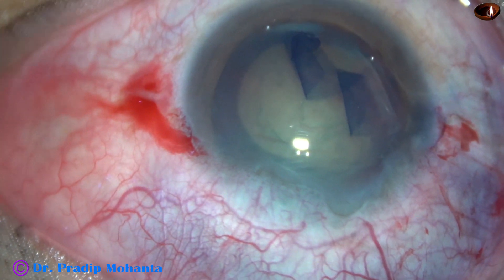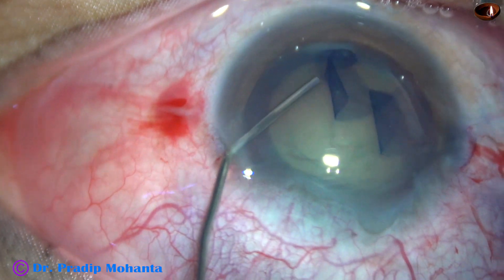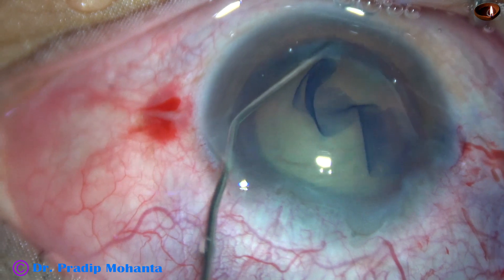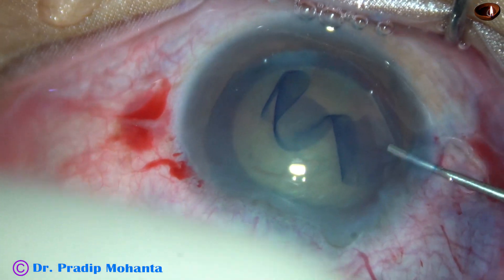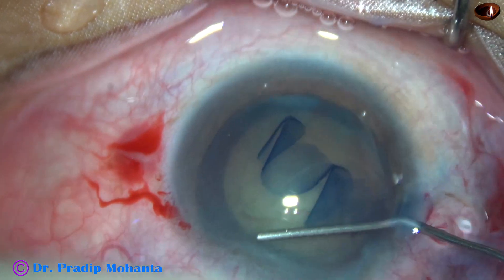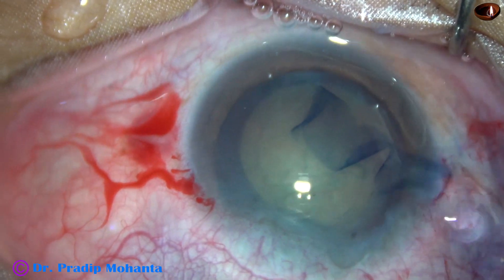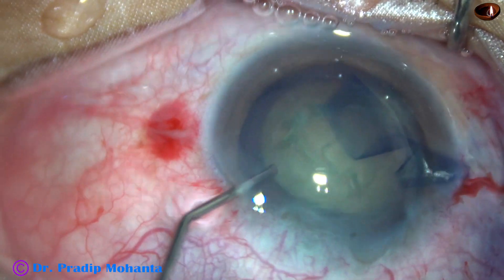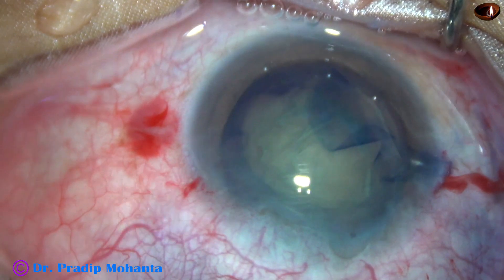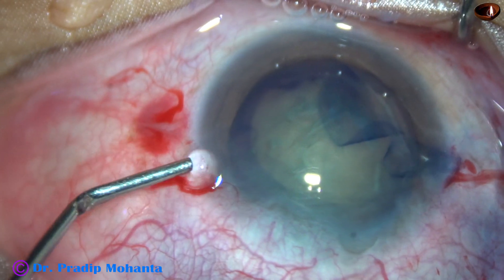And now hydrodissection. Hydrodissection is being done with the 27-gauge cannula and BSS at multiple points. I find that the nucleus is free from the cortex and it rotates nicely.